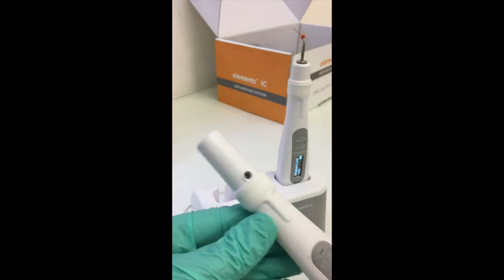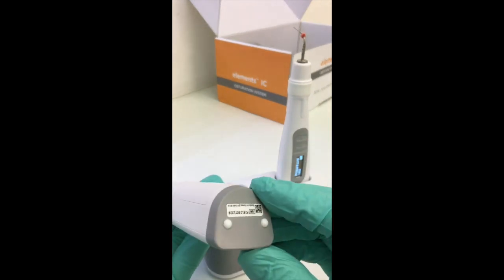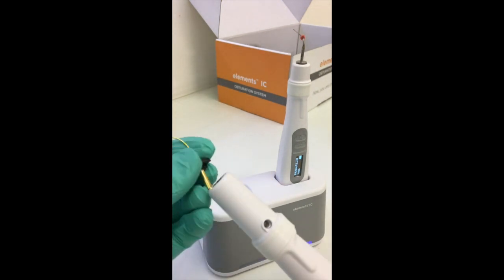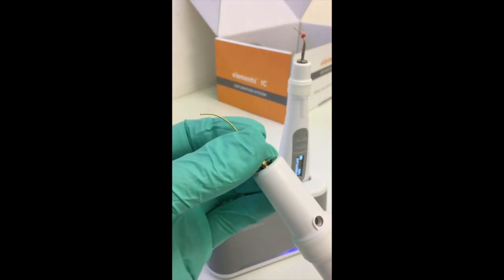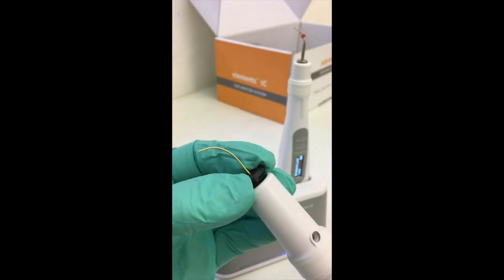The big advantage with our new IC model is the 360-degree touch control and the induction charging, which makes it much more practical in terms of cleaning and therefore a simpler and more predictable unit to work with.